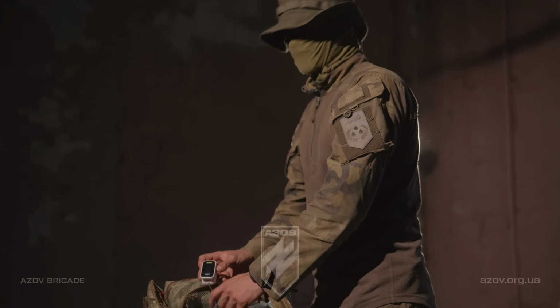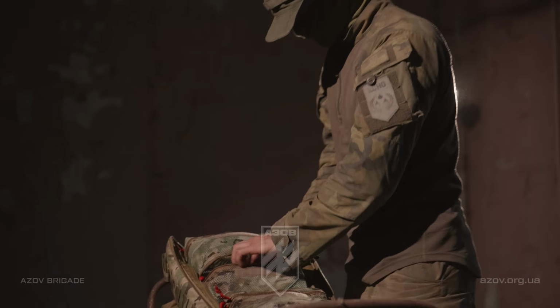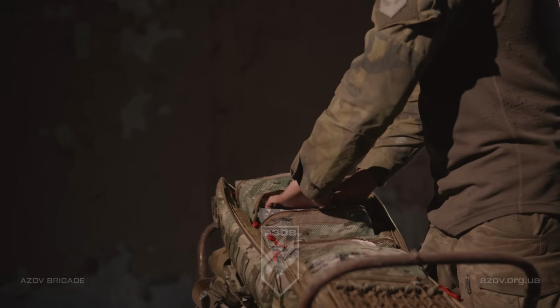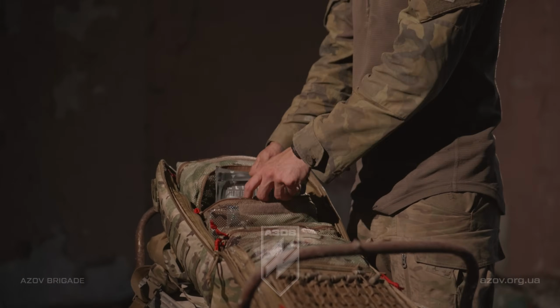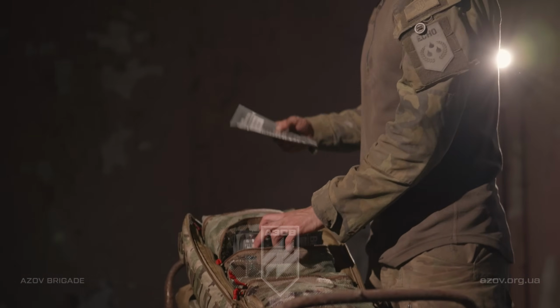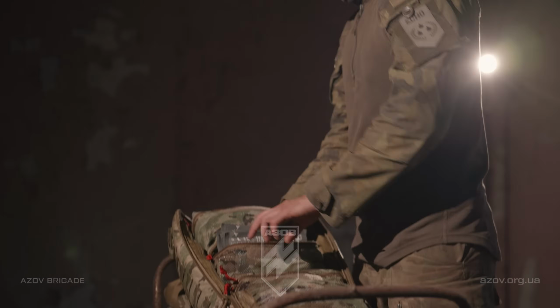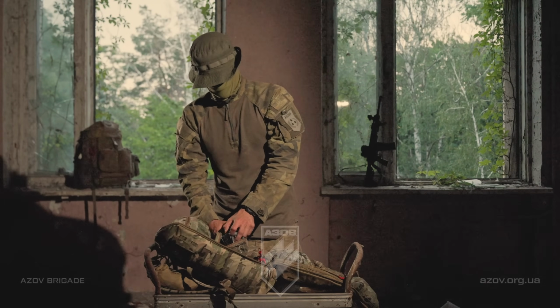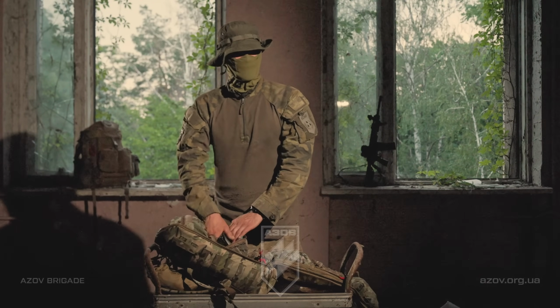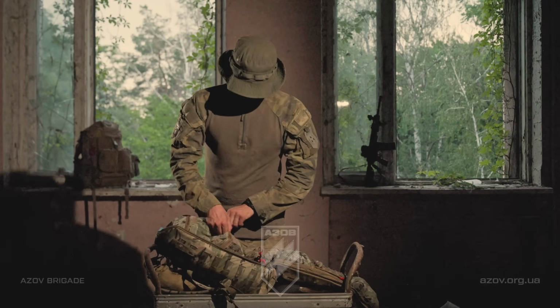In here, they have their SpO2 monitor. Again, that's used for monitoring vitals. Well, some of the vitals you need to monitor, not every vital. The rest of it you've got to do by yourself. Chest seals. The brand they use here is Beacon chest seals. Pretty good, I've used them. They're quite large, they're very sticky. They're giving you about 12, 13 chest seals here. But again, I like to carry 15, 16, just having those couple extra.